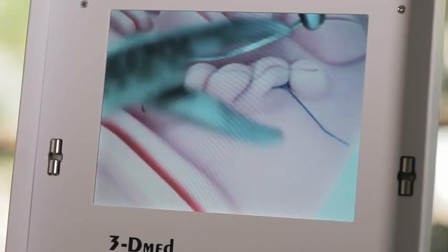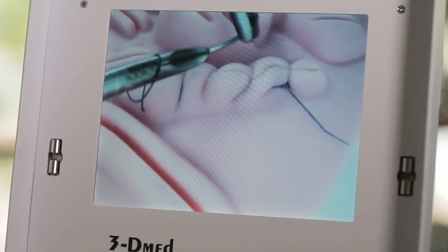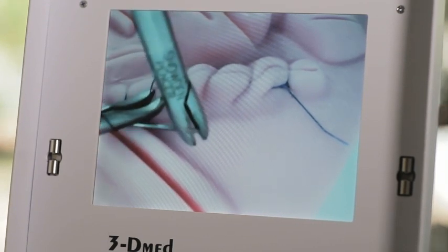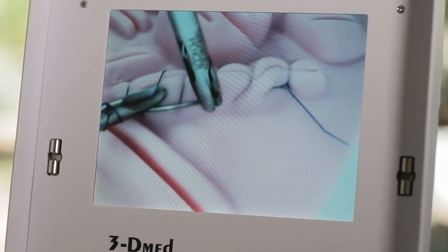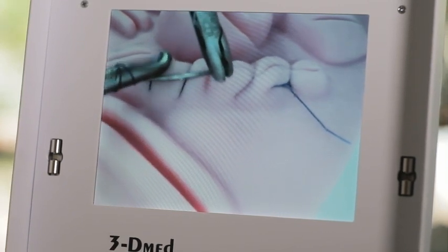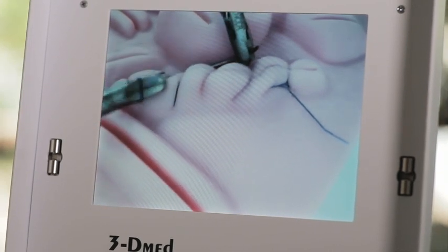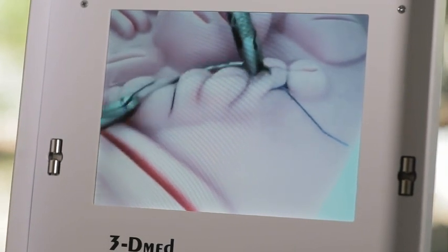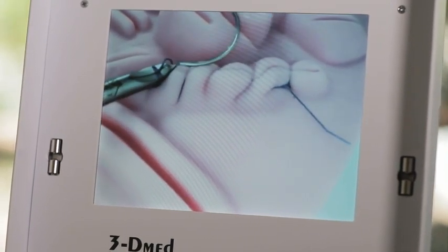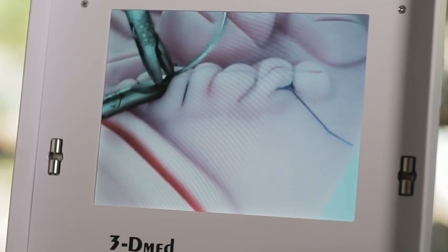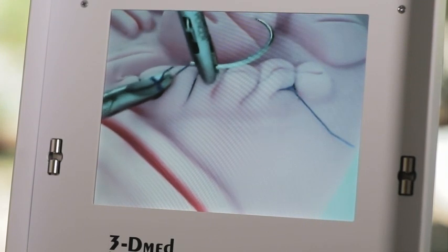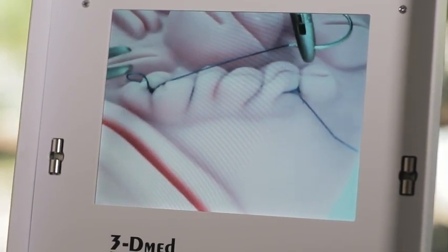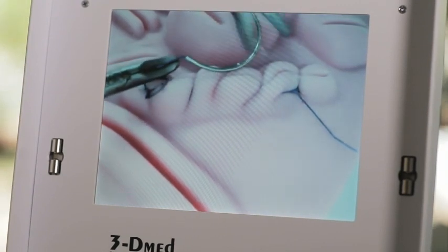I'm going to wrap it with a surgeon's knot. I don't have much left so I have to get very close. I'm going to pick up the last suture. I'm going to disgorge this by pulling in a collinear fashion with the grasper. I'm going to assist myself by helping to disgorge that because I've left myself with very little. And there we go, finally. I have a little loop to tie on but a little more slack this time.